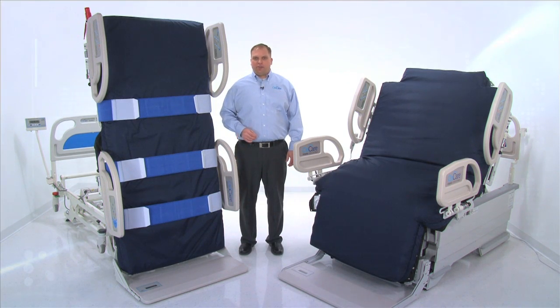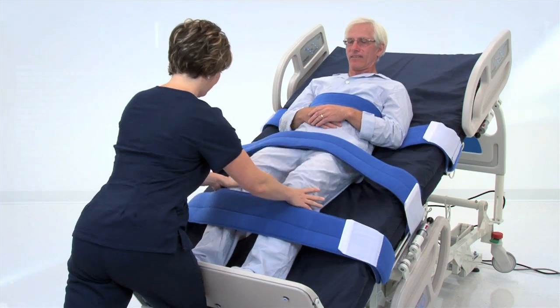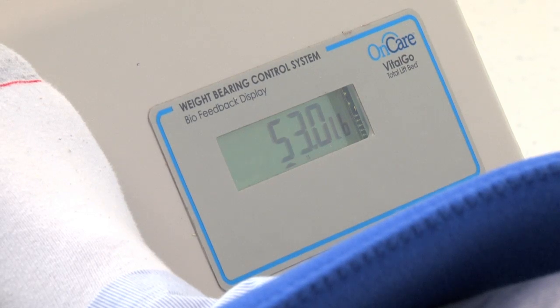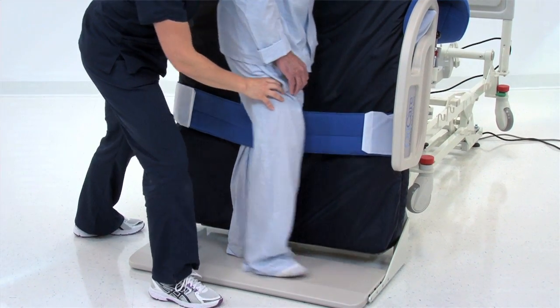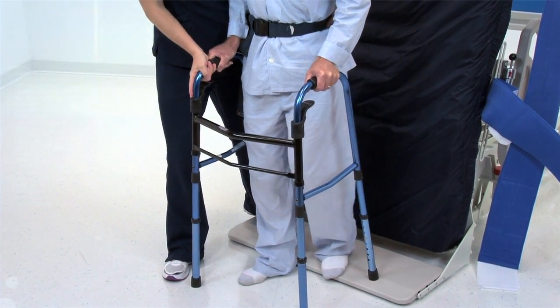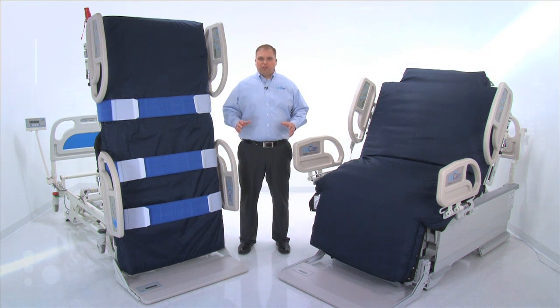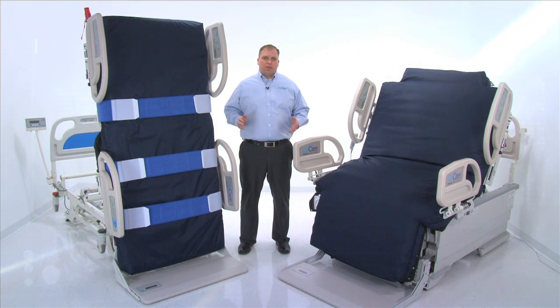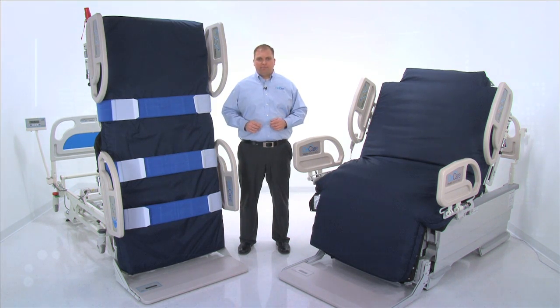Outside of focused physical therapy sessions, the Total Lift Bed offers the revolutionary ability to further patient rehabilitation through interval weight-bearing therapy. As patient strength and tolerance improves, the bed is progressively tilted, weight-bearing ratios are increased, and additional physical therapy or occupational therapy exercises are added until the patient is ready to ambulate. The OnCare VitalGo Total Lift Bed is truly a revolutionary tool that will improve how you care for immobile critical patients. The unique combination of tilt functionality and the weight-bearing control system combine to offer unmatched early mobility therapy options designed to accelerate patient recovery. Thank you.